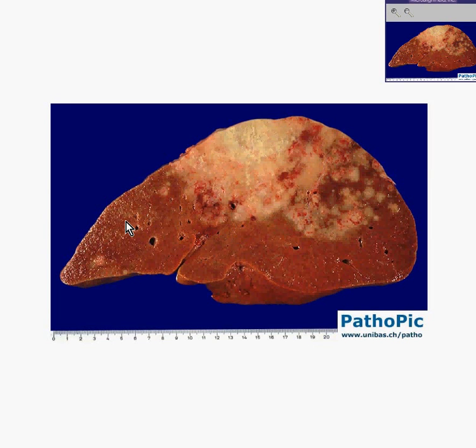Here is another liver that is abundantly apparent from this gross cut section. And notice that in the upper parts of the liver, there is a tumor which replaces much of the liver and certainly most of this upper portion. Notice that centrally the tumor looks like it is perhaps very fibrotic, maybe even necrotic. Notice as it grows out that it is often interspersed between clumps of normal or perhaps congested liver tissue. Also notice that there are some islands that are pretty far out as well.